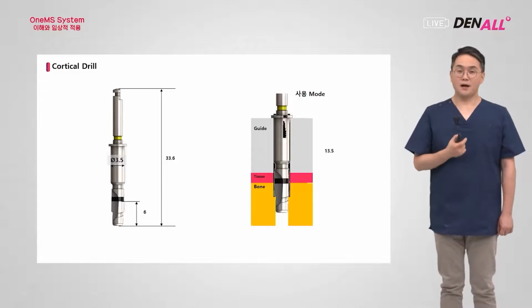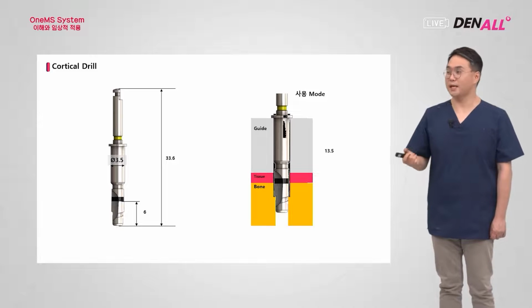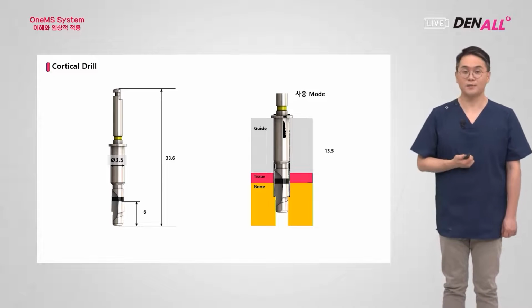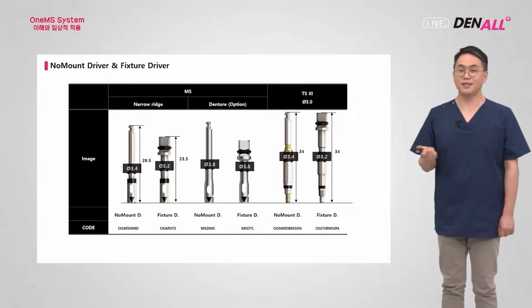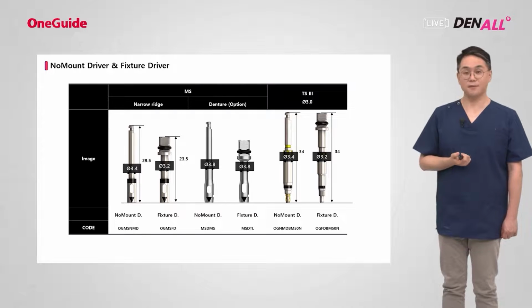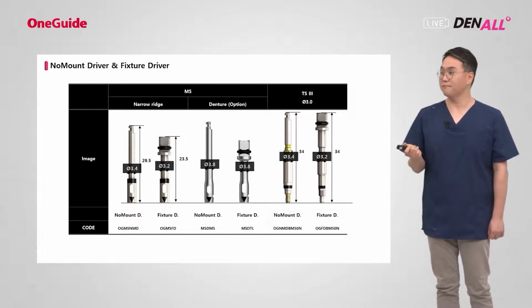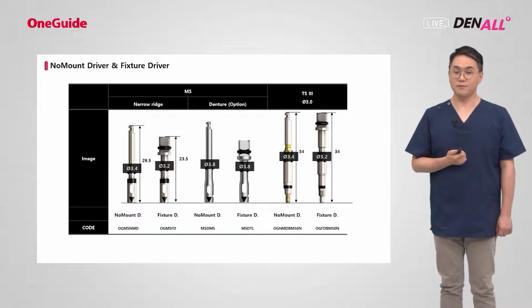And also, on the lower part, if you have D1 bone and you have excessive torque, then compression necrosis or bone heating could be the result. So the cortical drill can be used to overcome such challenges. And to place the implant, you have drivers, narrow ridge type. The MS implant can be used with this driver, and other types of implant can be used with their matching drivers.